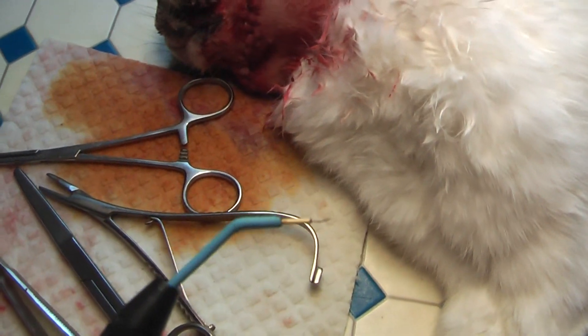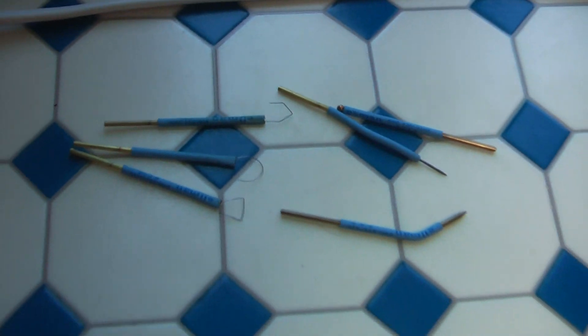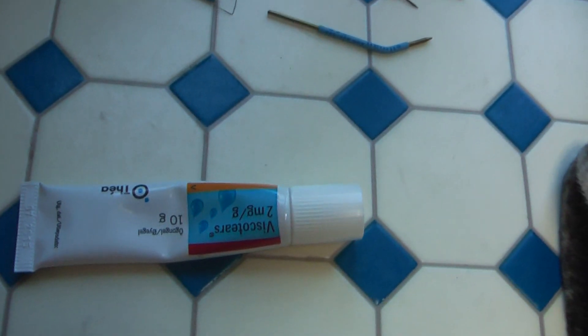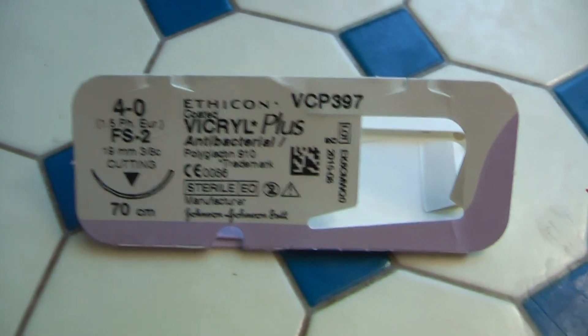And then you cut with this one, or you can use these two — some of them are broken, I have to get new ones. As I said, I'm going to give a demonstration. This here is something I put in the eyes so they don't dry out — they have to be kept moist. And for suture.